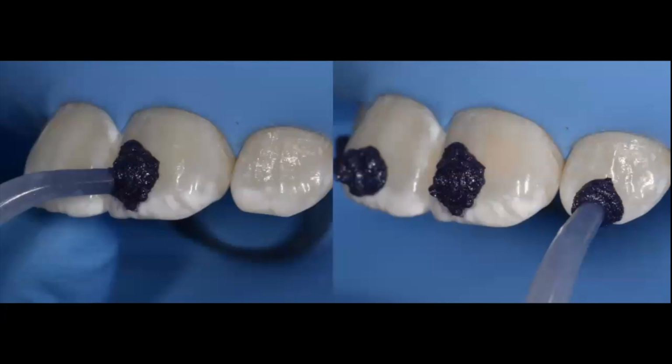It also has some carbide particles and has a very nice special cup that has very stiff bristles, so that you also have some mechanical removal of the enamel and the white spot at the same time, if you're having chemical removal of the enamel, right? So you are going to eliminate maybe, I would say, 40 to 70 microns of enamel, depending on how many applications you do of this product.